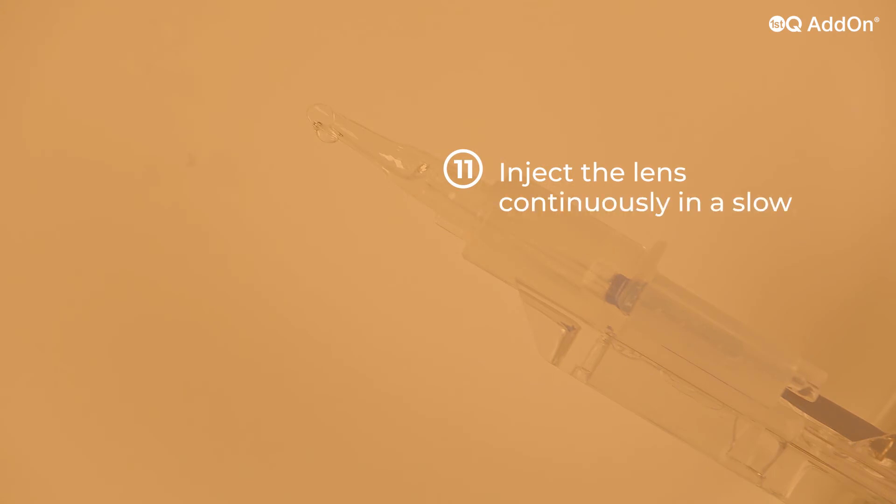Inject the lens continuously in a slow and controlled manner until the lens has fully unfolded. Do not over-push the silicone tip.